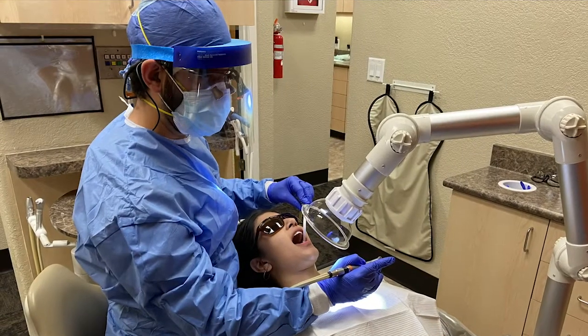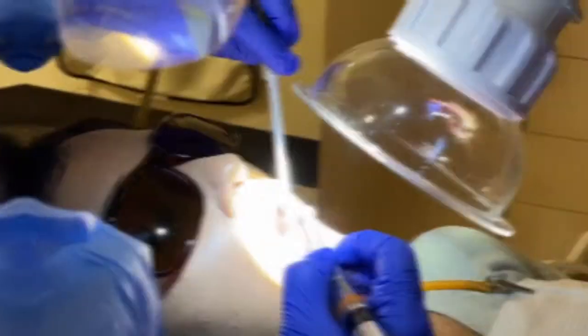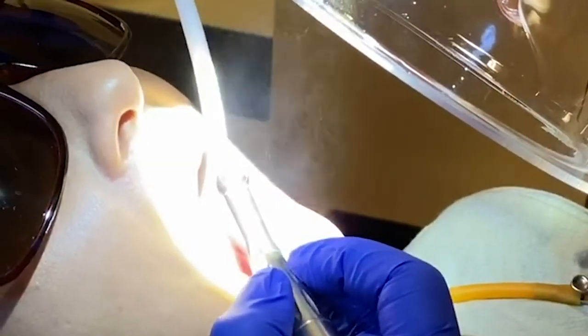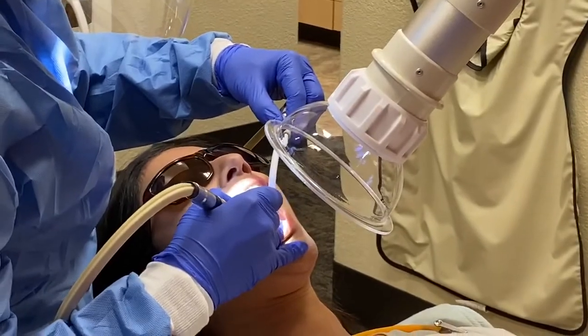My name is Dr. Gafrapour and this is the CB Lab Safety Microsaliva Extractor. This machine utilizes a powerful vacuum to suction micro droplets that propel into the airspace. As we know, these droplets can contain fragments of the coronavirus.